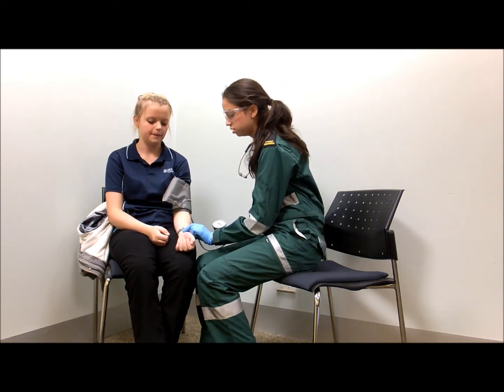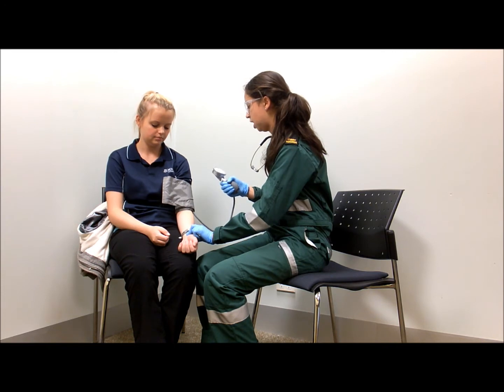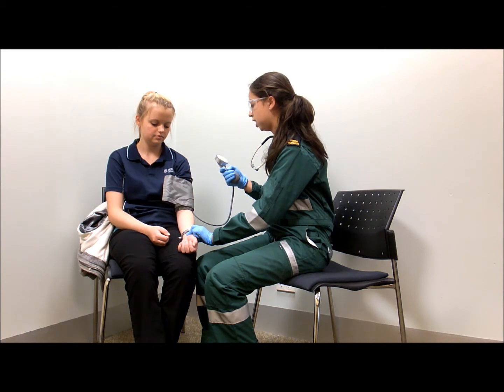And once I've found her pulse, I'm going to pump up the blood pressure cuff until I can no longer feel this pulse. Once I've reached this point, I'm going to slowly release the pressure on the blood pressure cuff until I can feel her pulse again and record this as her systolic blood pressure.